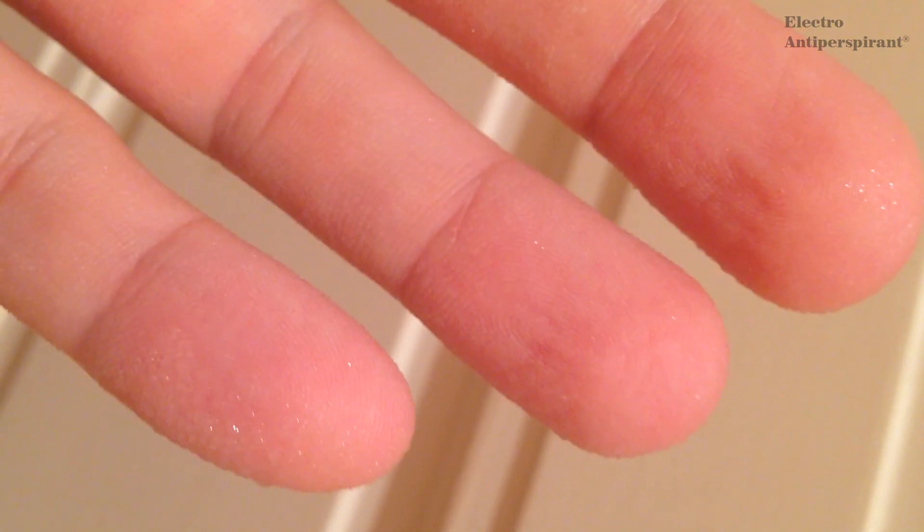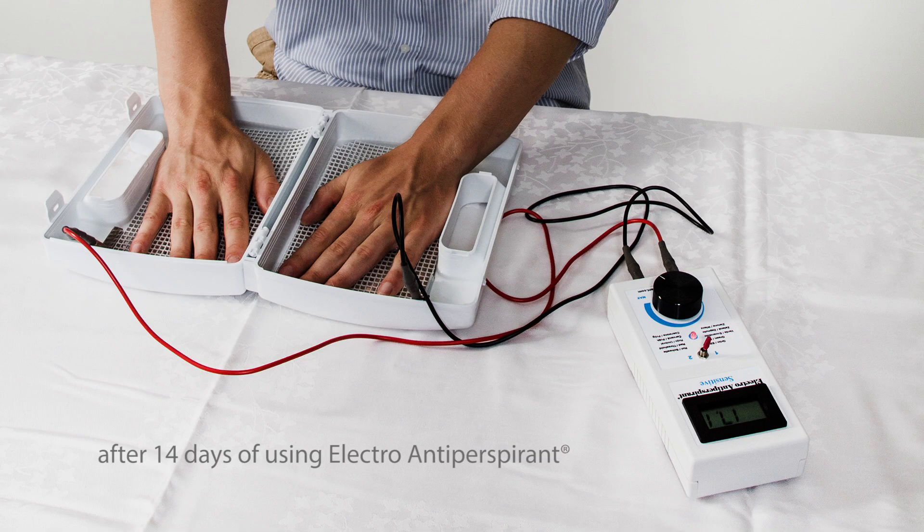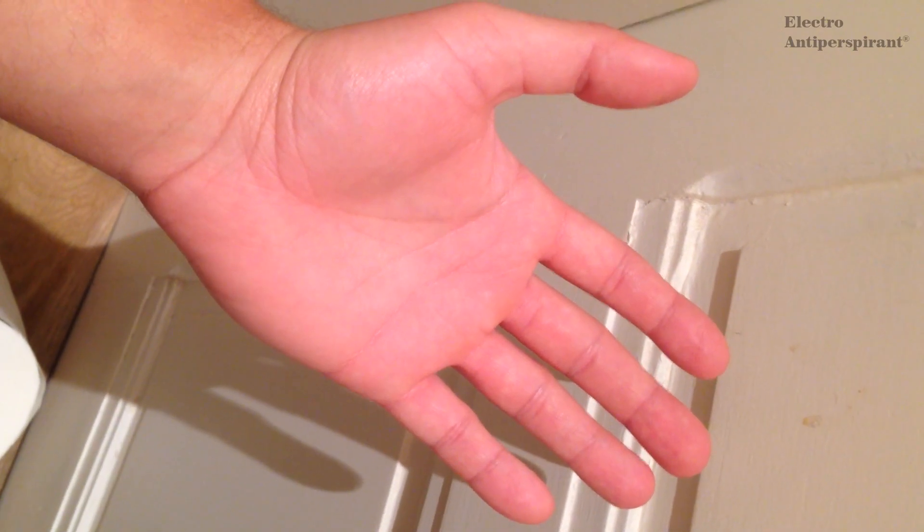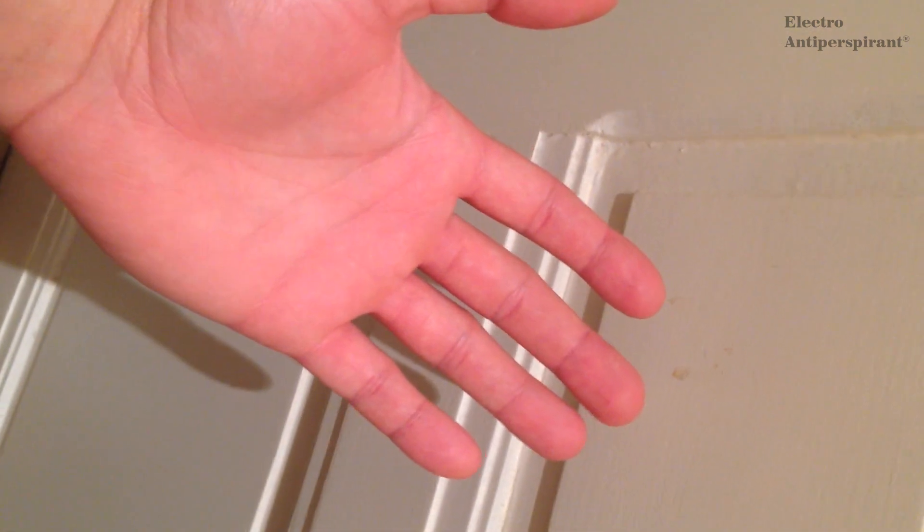Now we can try the electroantiperspirant device for it. Hello everybody. I have some results here of using the electroantiperspirant device for my hyperhidrosis.